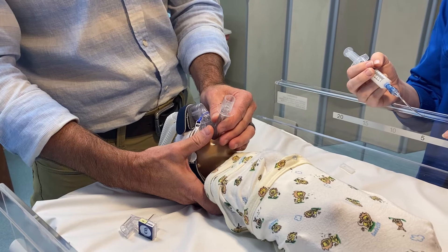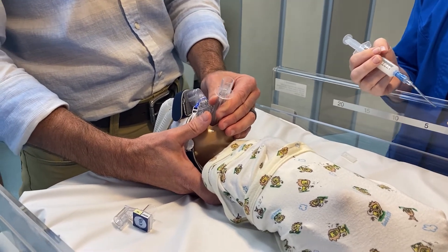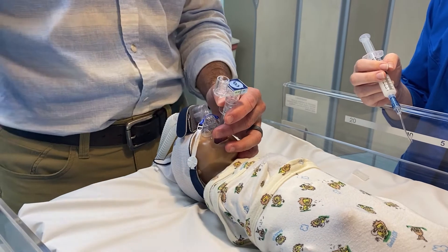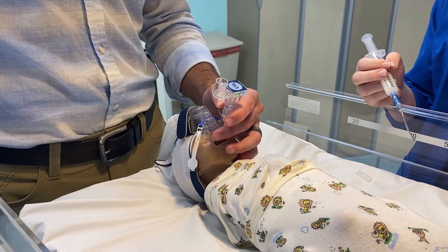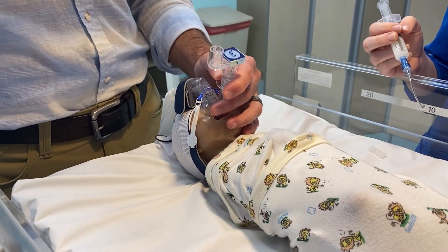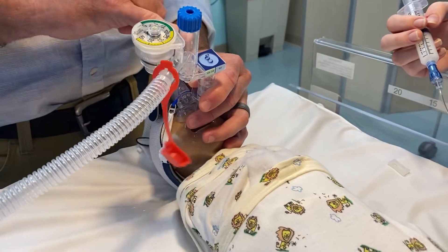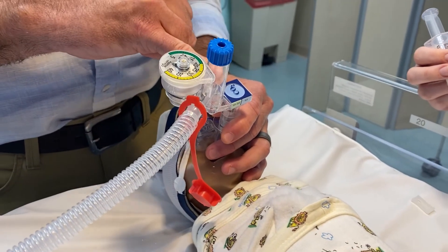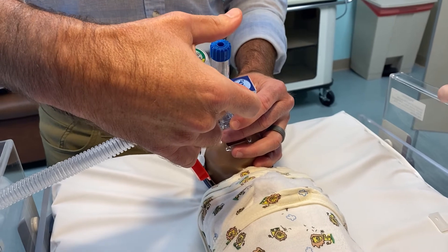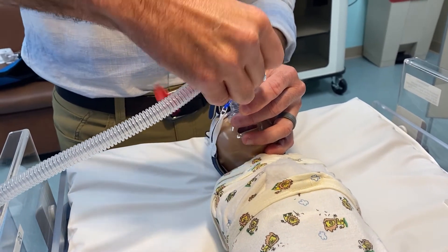Once the device has popped into place, give it a nice little push — you may feel it bounce up and down slightly, and then you know you're in a good position. If you want to check position and have CO2 detectors available, place one on and give breaths, making sure you see a color change. In a real human being you're going to see it turn yellow, confirming your supraglottic airway device is in the right place.